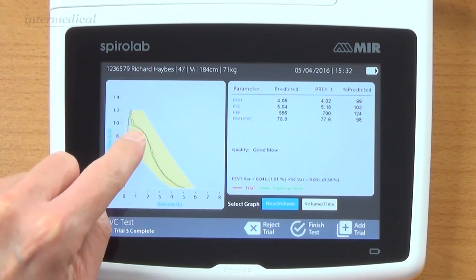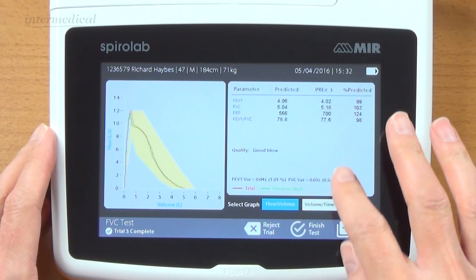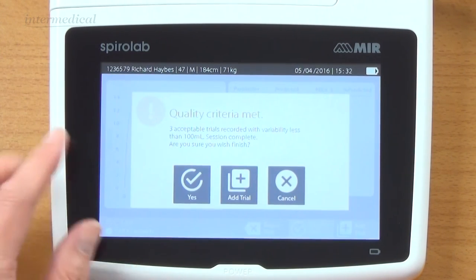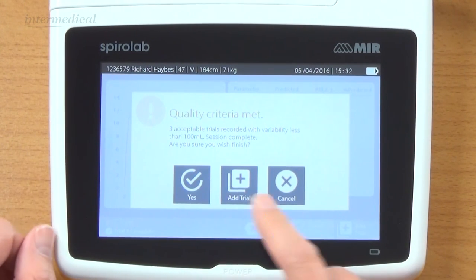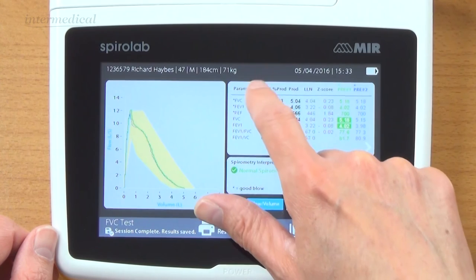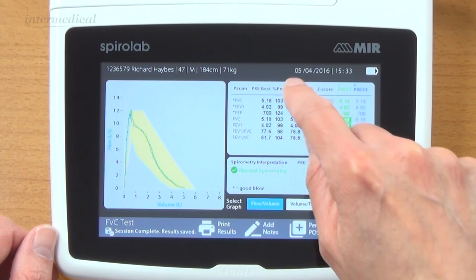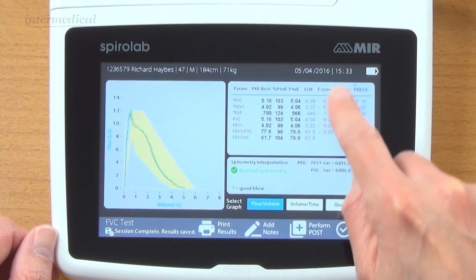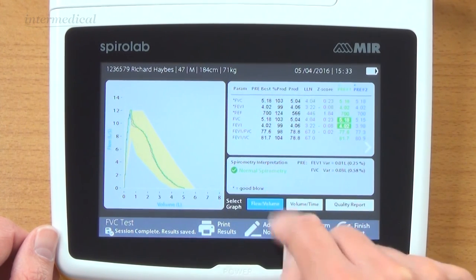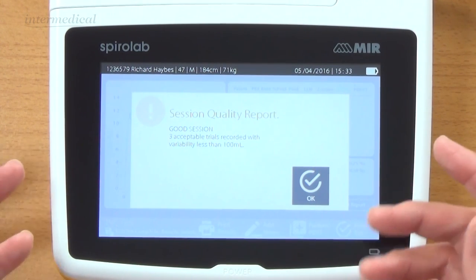Trial three completed. Graphs are overlaid, reproducible, no variation. The actual percentage variation is pretty reproducible compared to predicted. I'm happy with that - finishing test. It tells us we've met the criteria. Now we get all the results up for that test. For my best test, we can see all of the parameters: percent predicted, actual predicted, lower level of normal, and also the Z score, which is really useful. You can see the variation on screen. Interpretation is normal spirometry.